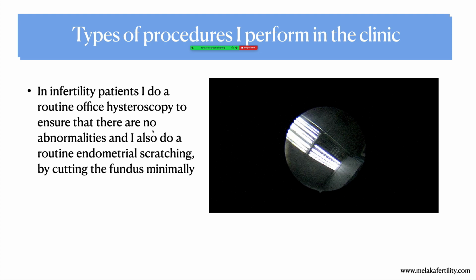to look for any abnormality. And also I am a believer of endometrial scratching. Now most people do endometrial scratching when there are two or more uterine implantation failures, but I believe that it has its benefits, so I do it routinely for all my patients. So let me show you what I do.